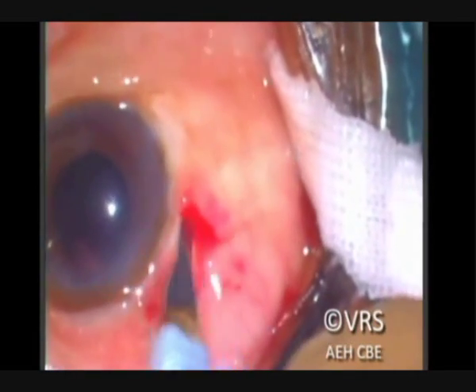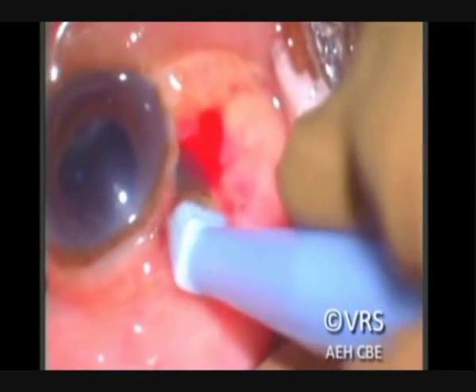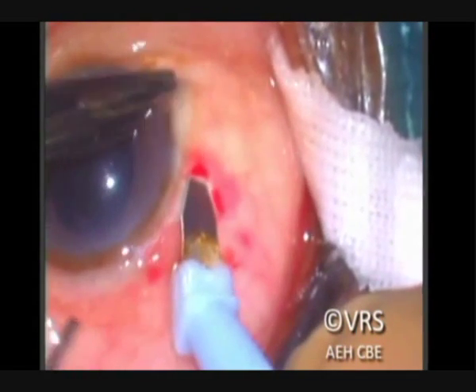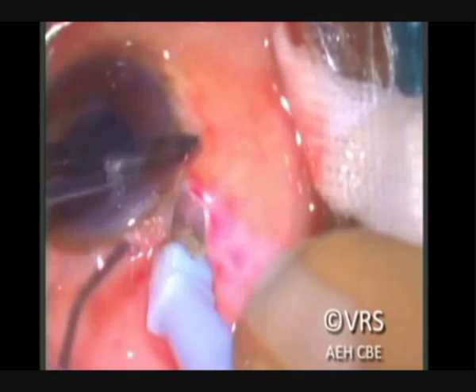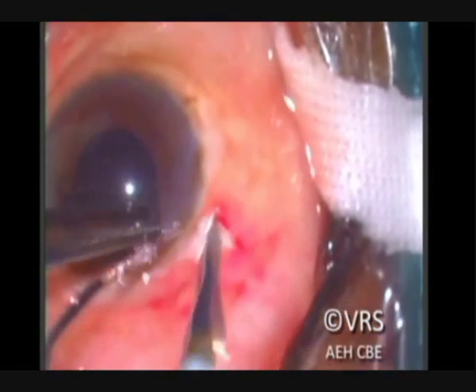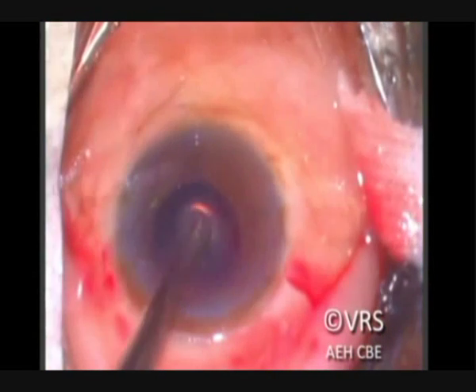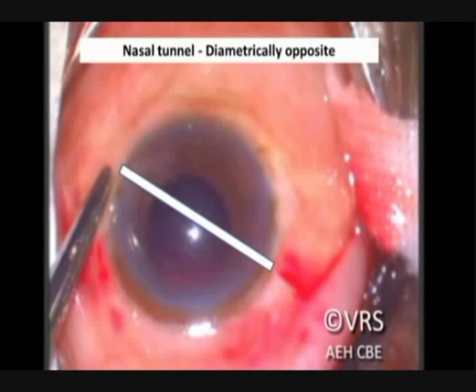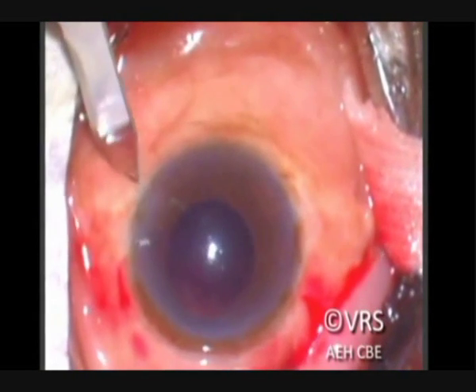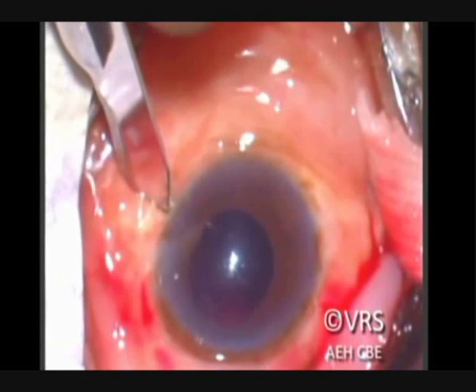For beginners, if they find it difficult to construct the tunnel under the conjunctiva, the conjunctiva can be opened and this tunnel can be made under direct visualization. The right side tunnel runs from up to down and the left side tunnel runs down to up, to accommodate for the angulation of the haptics which will be externalized and internalized into the scleral tunnel later.